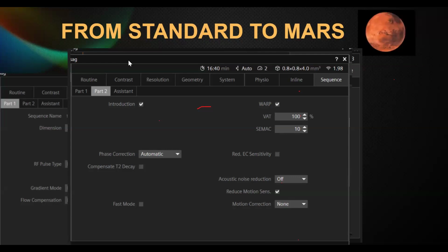You're welcome. No, I just want to know, when some patients have a prosthesis in the knee, and this prosthesis is completely in the femur and the tibia, do you use something special, or do these patients move to another exam, another study?